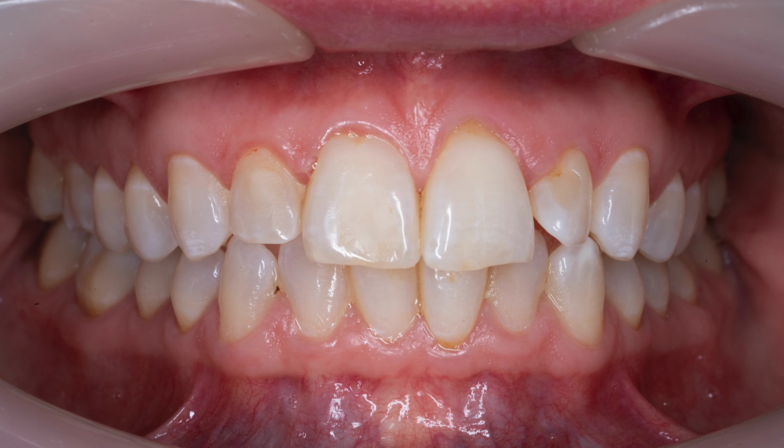So when taking intraoral photographs, we need to ensure we can achieve repeatable views while eliminating perspective distortion. So how do we do this? How can we ensure we get the same angle every single time? Well, we need a reference point, and the best reference point is the occlusal line. So when we take an intraoral image, we are aiming for the occlusal line to be straight across and in the middle of the frame.